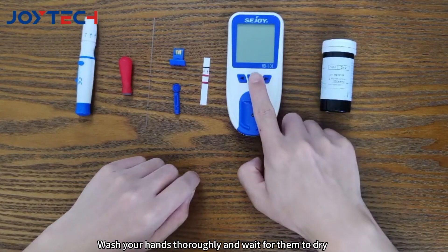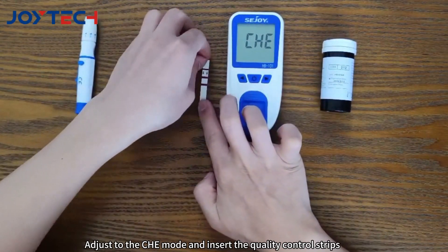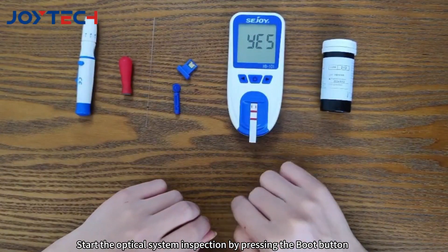Wash your hands thoroughly and wait for them to dry. Press and hold the boot button for two seconds to enter meter setup mode. Adjust to the CHE mode and insert the quality control strips. Start the optical system inspection by pressing the boot button.